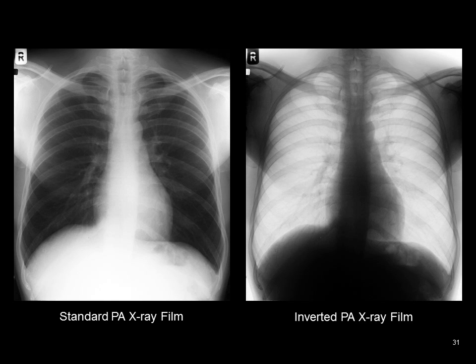We see the radiolucency of the lung fields because they're mostly filled with air. I'm outlining the costodiaphragmatic recess here for you bilaterally. We have the dome of the diaphragm over the liver, the dome of the diaphragm over the stomach. This is a gas bubble, gastric air within the stomach. Radiolucency of the trachea, so air in the trachea. You can see the vertebral column. And this is the cardiac silhouette.